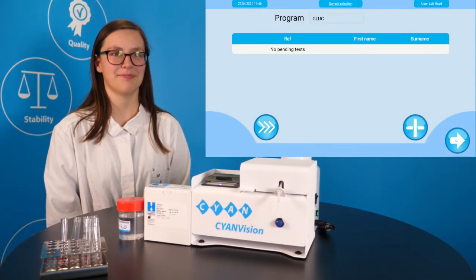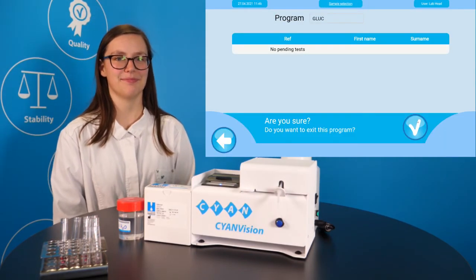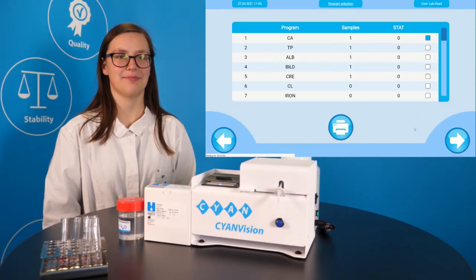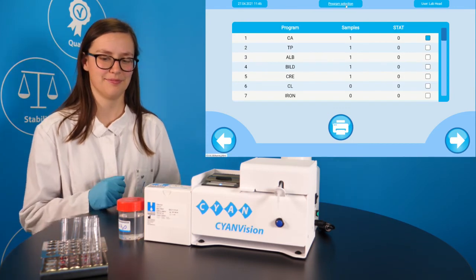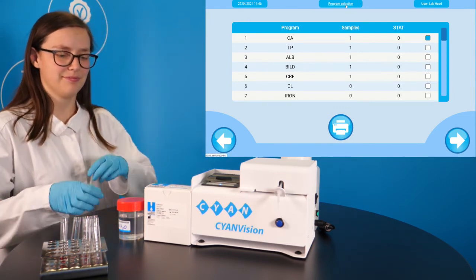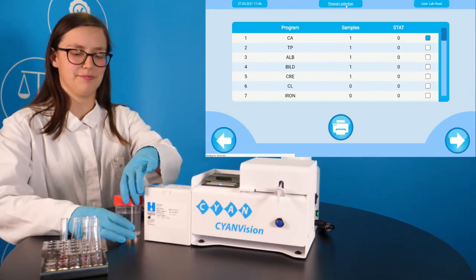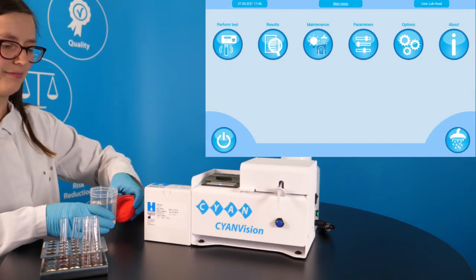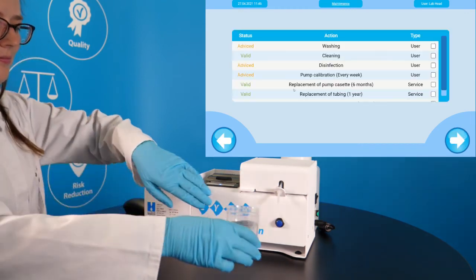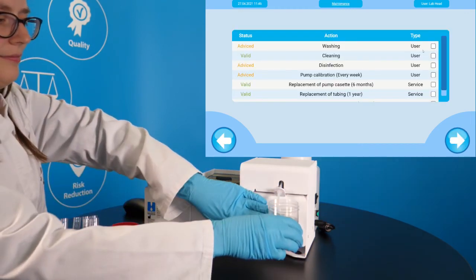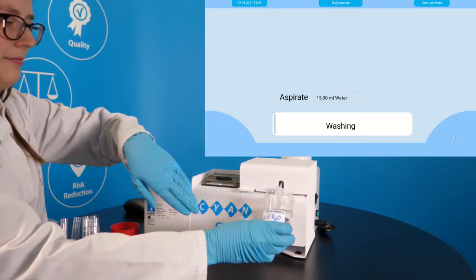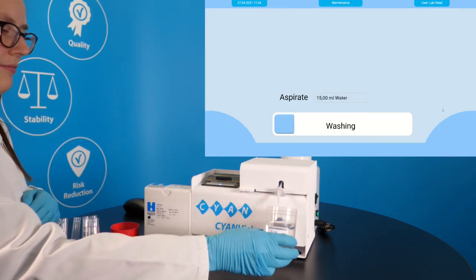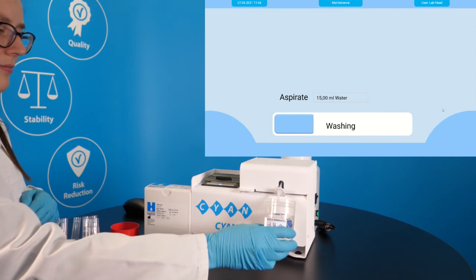After finishing all glucose tests, we would like to proceed with the next analyte. Before starting with the next method, it is good practice to wash the hydraulic system to avoid any cross contamination. You can do so in the maintenance overview menu.